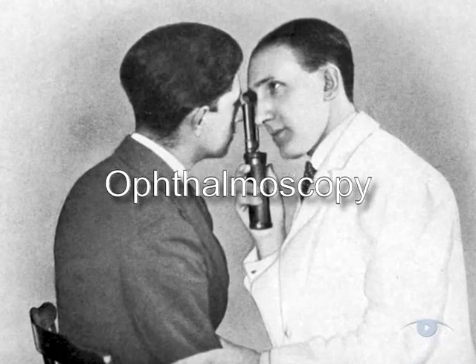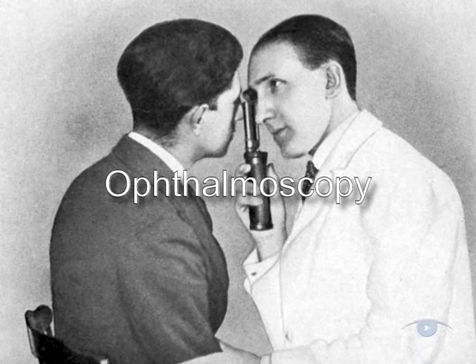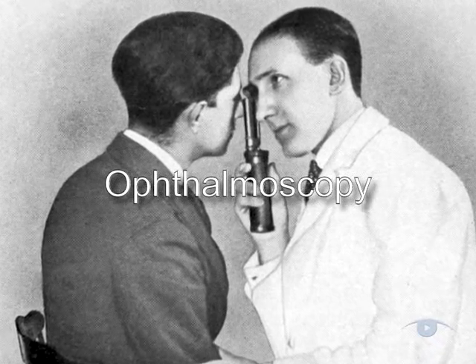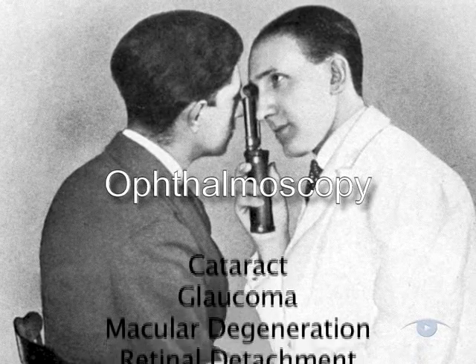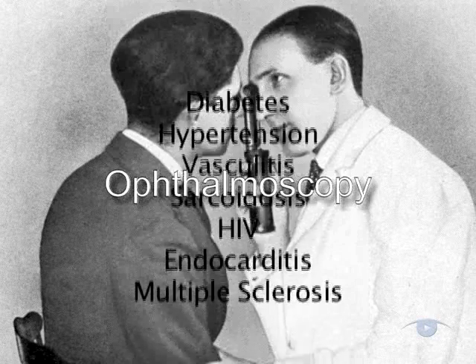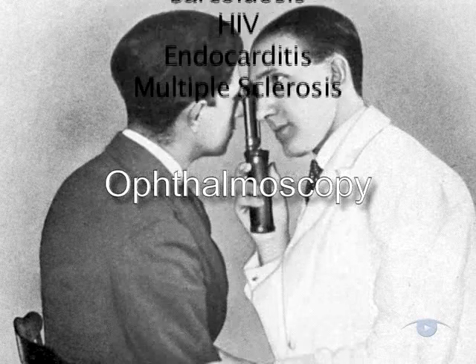Ophthalmoscopy is the examination through the pupil of the internal surface of the back of the eye, and it was introduced over 150 years ago. It remains an important skill because it will help you to diagnose not only intrinsic eye pathology but also systemic diseases through their ocular manifestations.